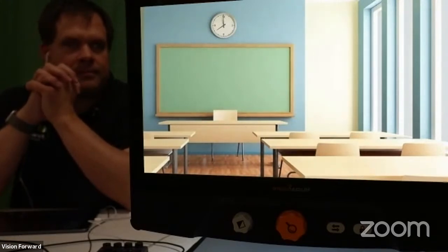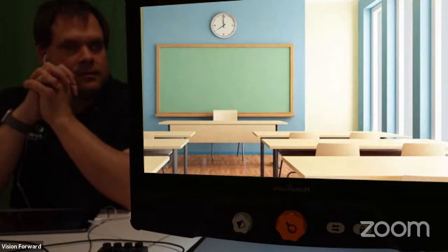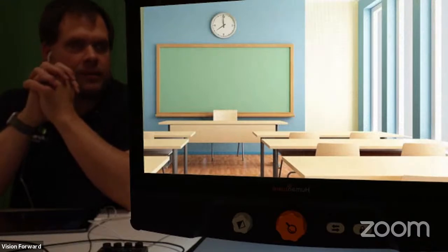And then to switch through to the Prodigy side, we just hit a button on the front of the device, and that would switch us through to the Prodigy side of the software. And in the Prodigy side, we can do all of the things that we just saw on the Connect 12. The big difference with this one is, in the Prodigy side, it does not have a distance mode, because the distance mode for this one is actually using the camera that's built into it, and that you do on the live magnification side of things.